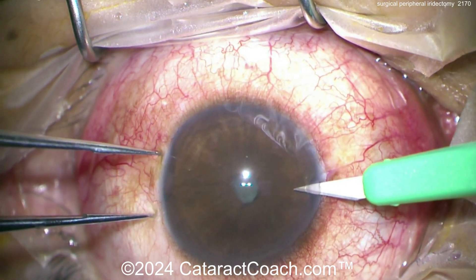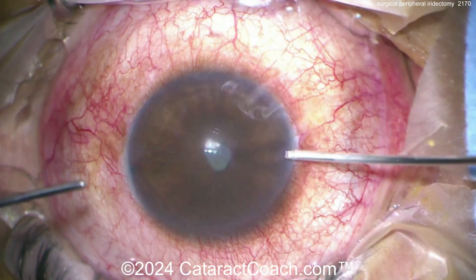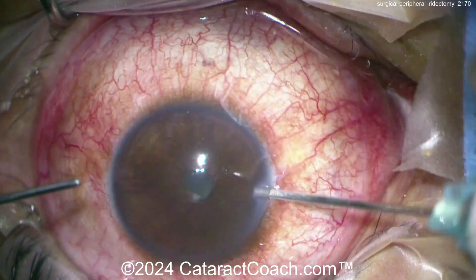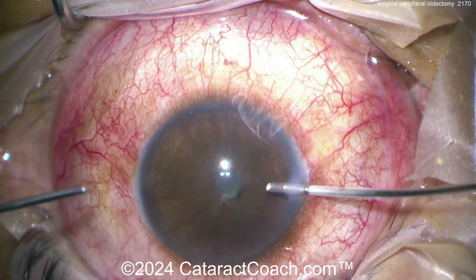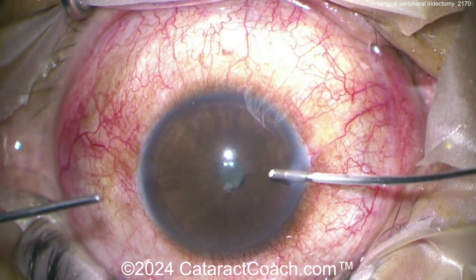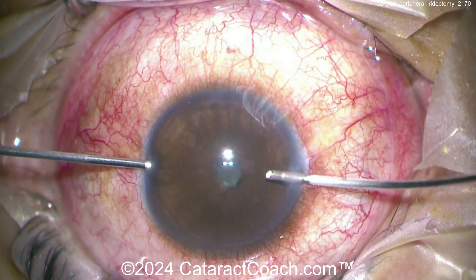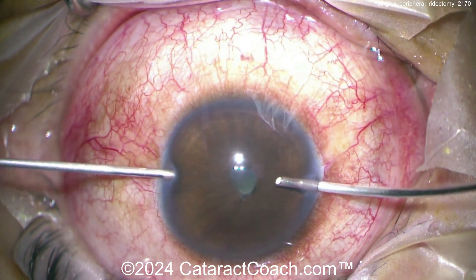Here's another pair on the opposite side. In this case a resident is operating and is going to do two peripheral iridectomies. Here's the 23-gauge vitrector going in — there's the infusion. Make sure that infusion tube is not going to obstruct your view, and now going over the cutter — think about what settings you want here.